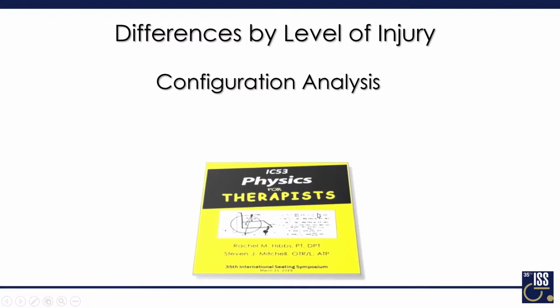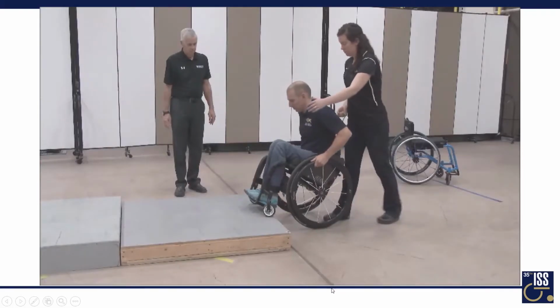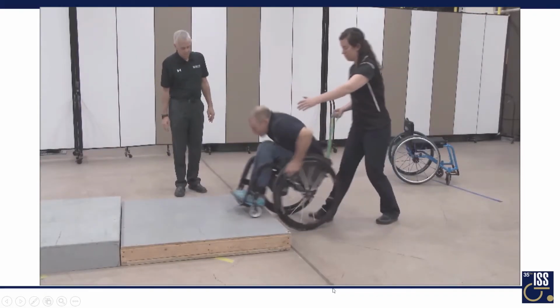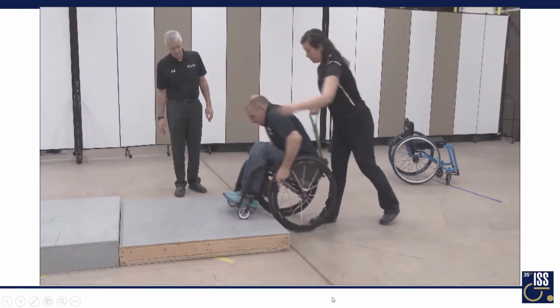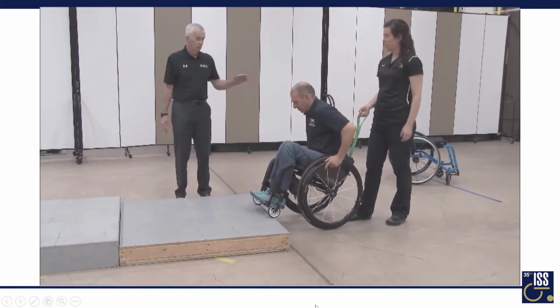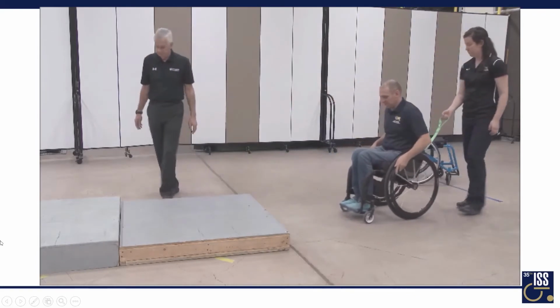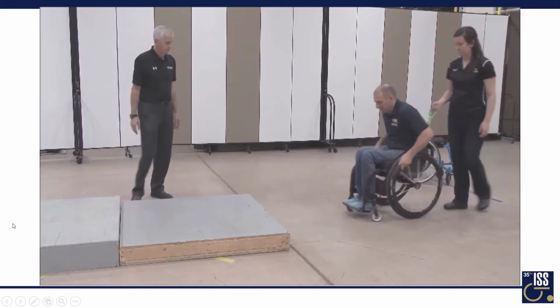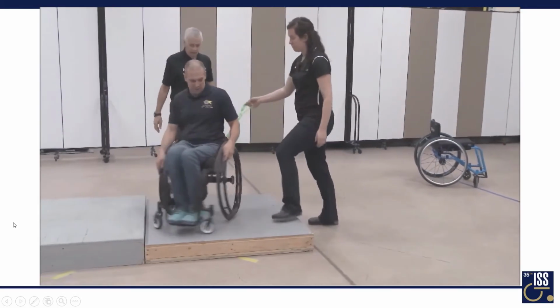I went the wrong direction. Okay, let's see if I can. So he's leaning over a good bit. He's purposely not moving his hands. But even though his center of gravity is just a little bit less than mine, look at how much of his body he's able to get in front of the rear axle. Almost all. Yeah.